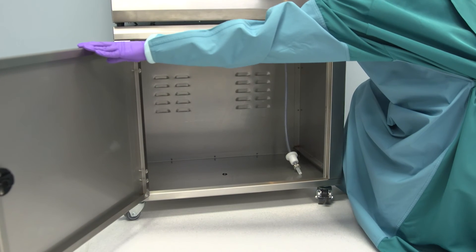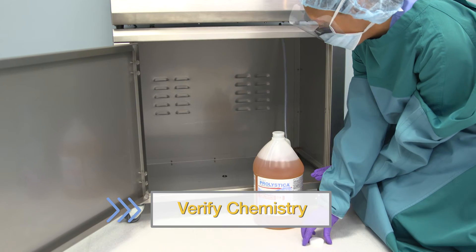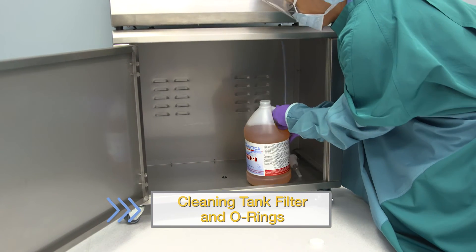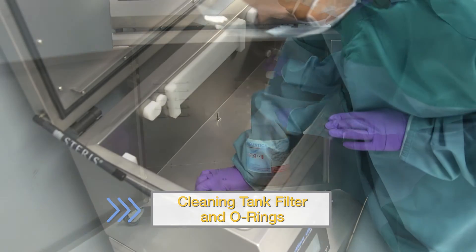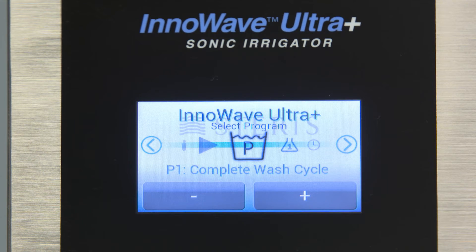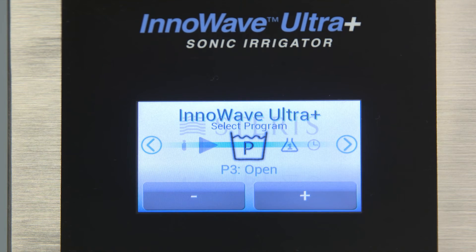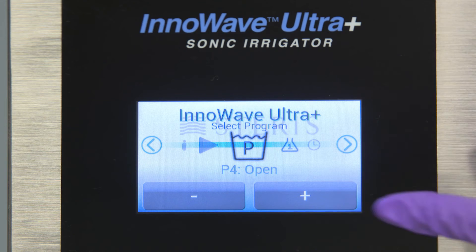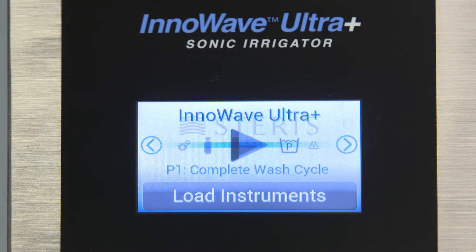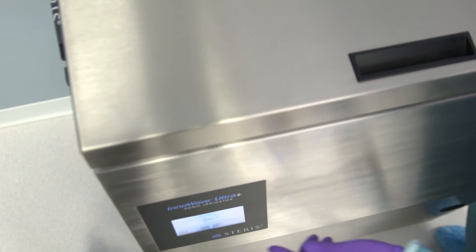The InnoWave Ultra Plus has three pre-programmed cycles and three spots for custom cycles. Before selecting and starting a cycle, complete all pre-cycle checks. This includes verifying enough chemistry is present for the next wash, inspecting and cleaning the tank filter and o-rings, and confirming the wash tank and spray nozzles are free from debris. Use the arrow keys until you reach the Wash menu, then use the plus and minus buttons to scroll through until you reach the appropriate cycle for the instrument set. Use the arrows to scroll back to the start icon, close the unit's lid, and push the start button to initiate the cycle.